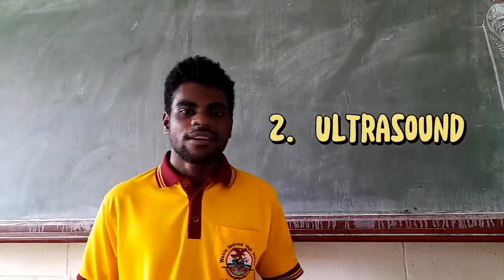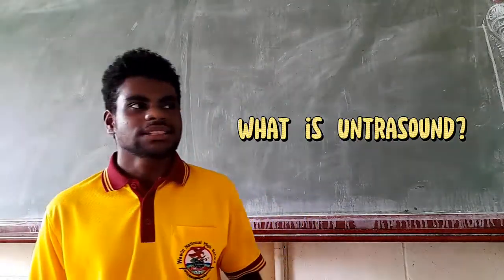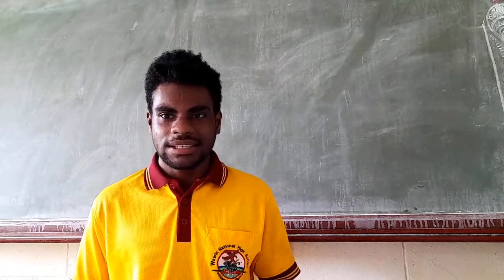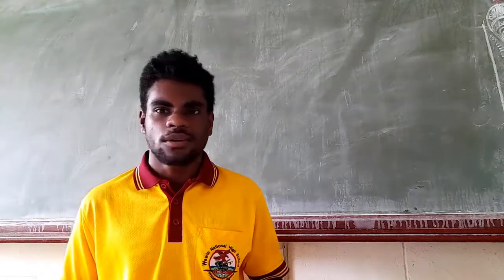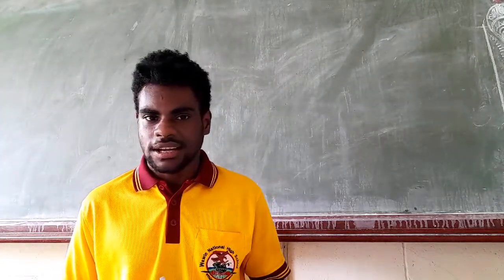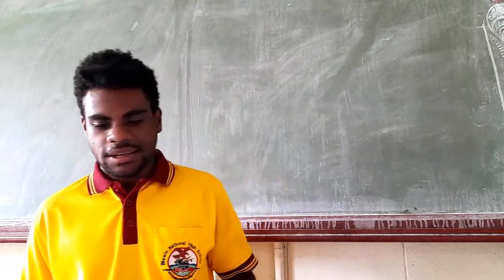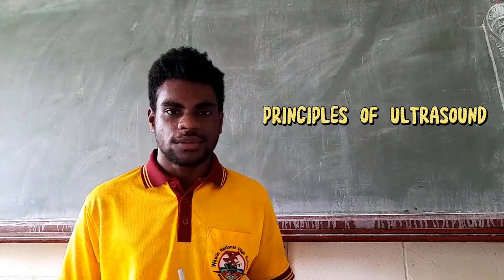Now, secondly, I will be talking about ultrasound. So, what is ultrasound? Ultrasound is an imaging test that uses sound waves to create a picture of organs, tissues, and other structures inside the body. And what are the principles of ultrasound?